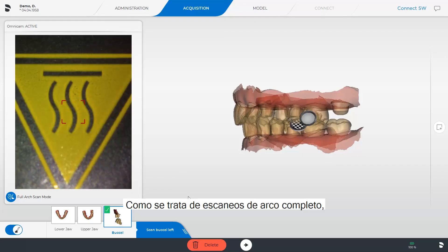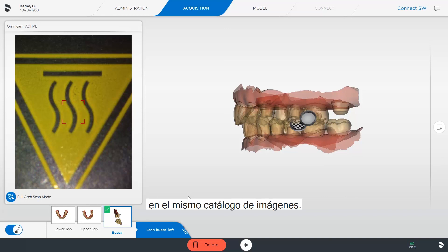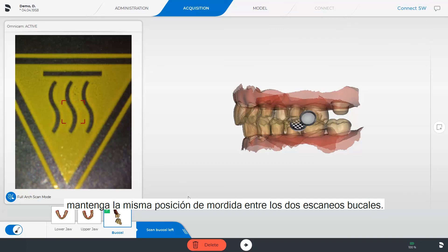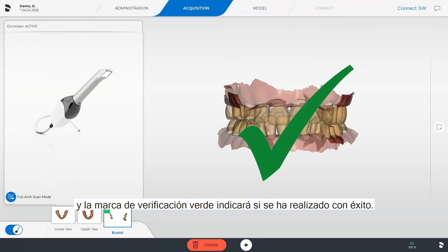Since these are full arch scans, you will perform a buccal scan on the left side in the same image catalog as well. It is important for the patient to maintain the same unchanged bite position between the two buccal scans. The sequence is the same as before and the successful completion is indicated by the green check mark.